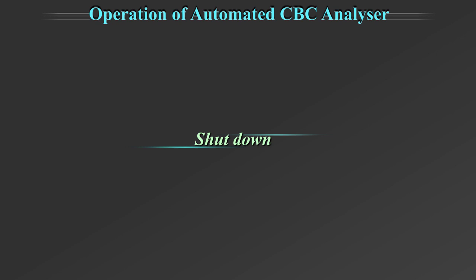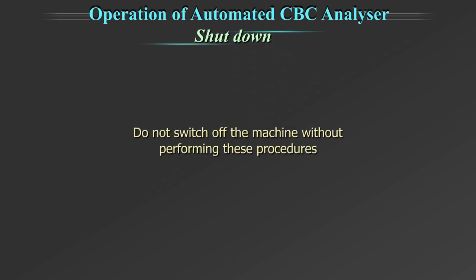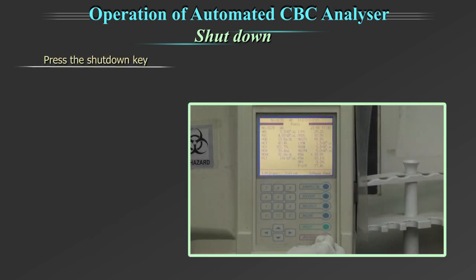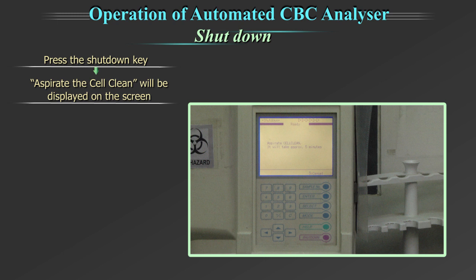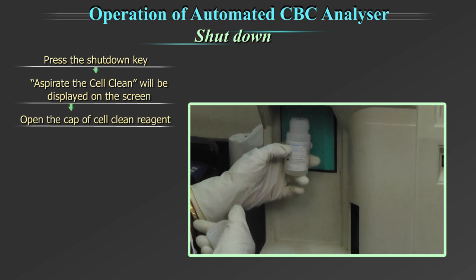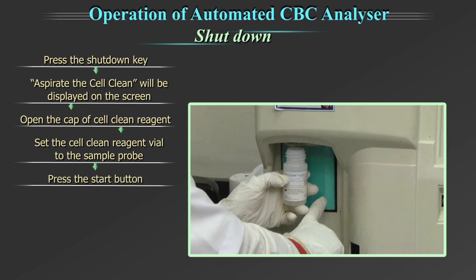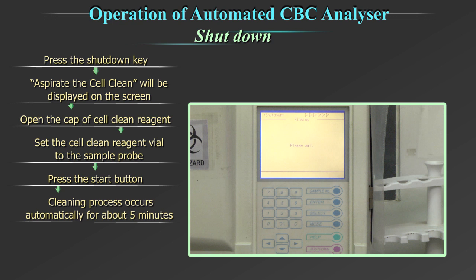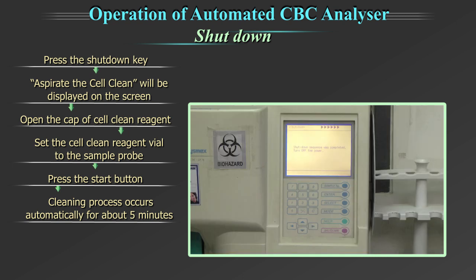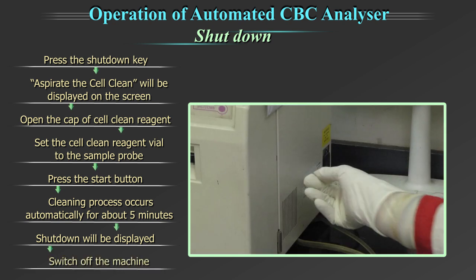For the shutdown process at the end of the day: do not switch off the machine without performing these procedures. Press the shutdown key. 'Aspirate the cell clean' will be displayed on the screen. Open the cap of the cell clean reagent, set the cell clean reagent vial to the sample probe, and press the start button. The cleaning process occurs automatically for about 5 minutes. After completing the process, 'shutdown' will be displayed on the screen. Now switch off the machine.